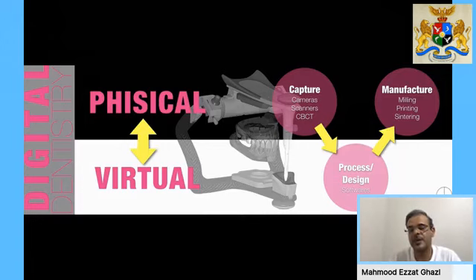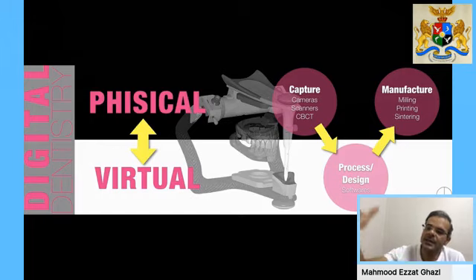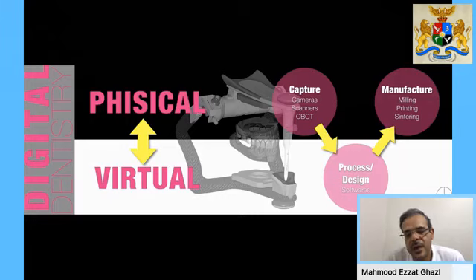So you can see your patient in layers, and you can take as much time as you want with that patient to see everything that you need in 3D and start to really treatment plan this case correctly, and then give a virtual final result for yourself and start to see how you would reach that. One of the other advantages of digital dentistry is you have the end in mind, meaning that you can plan everything ahead, you can see the end in mind, and then plan back, which we call reverse engineering, to get from the starting point to the end point.